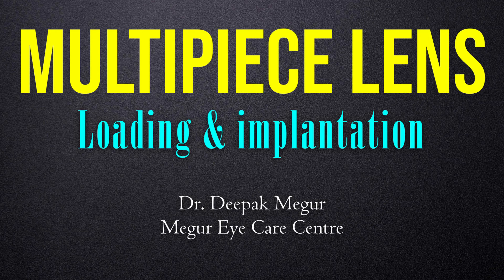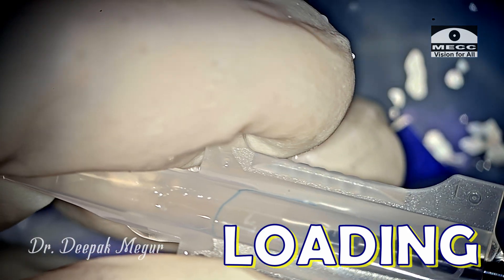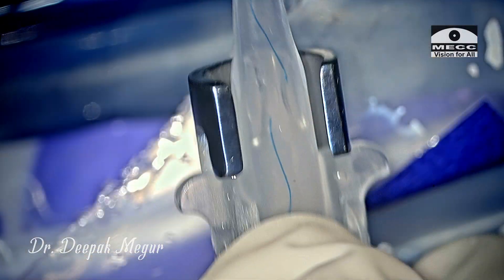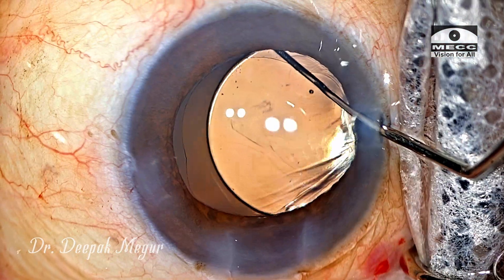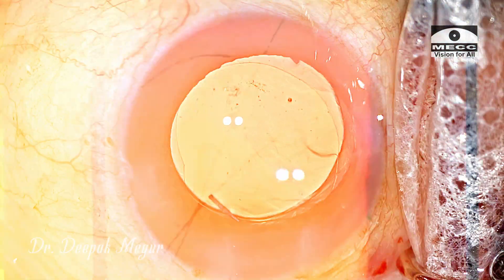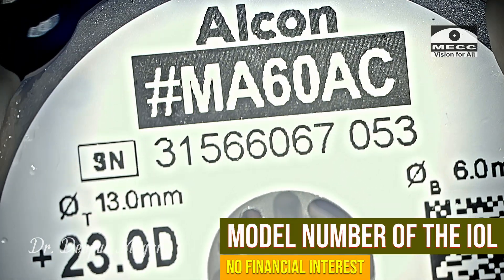In this video we'll learn about the technique to load a multi-piece IOL. I'll be demonstrating the usage of the C cartridge for loading the multi-piece lens. The multi-piece lens being used in this video is the Alcon MA60 AC lens.